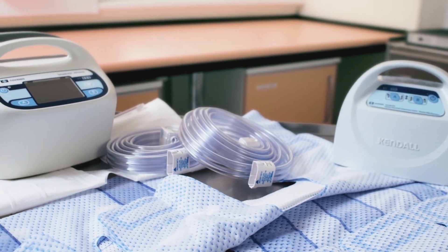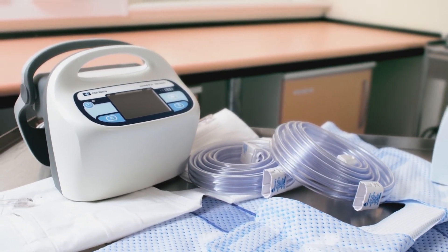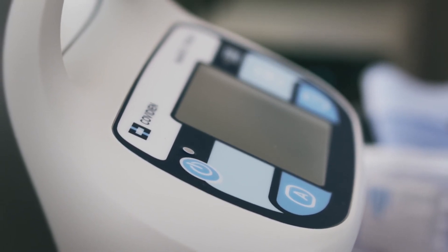The Kendall SCD Smart Compression System is the most clinically studied IPC device on the market, delivering a unique combination of circumferential sequential gradient compression with vascular refill detection and patient sensing technology to help reduce the risk of both DVT and PE in at-risk patients.